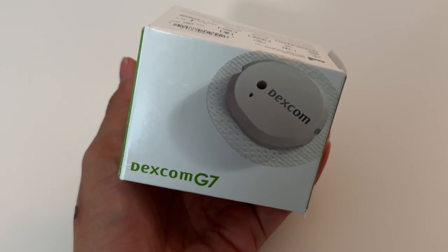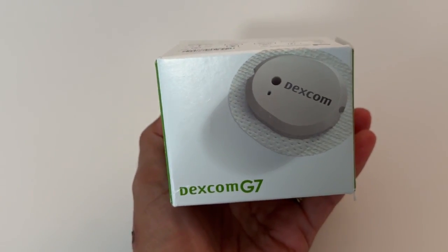Just the other day it happened again. I had lost signal, and of course it was not an ideal time — I was out for a walk, and it's so frustrating. And I know it's not just me; plenty of you guys are experiencing signal loss as well. I upgraded to Dexcom G7 from G6 in the spring, and I overall think the G7 is an upgrade from the G6 or any of the other CGMs available on the market. However, the lost signal has been driving me bonkers.